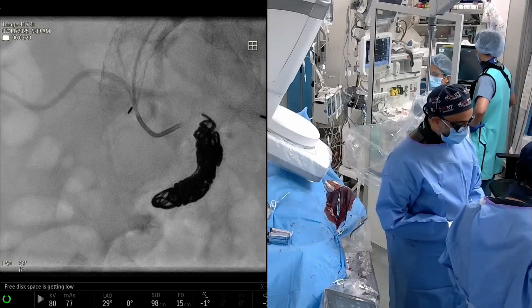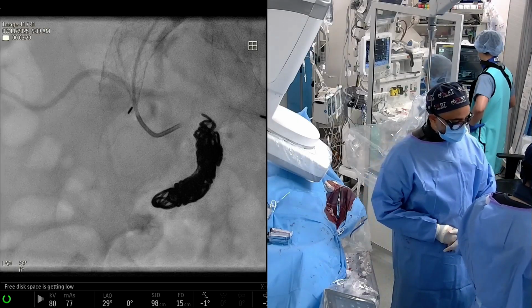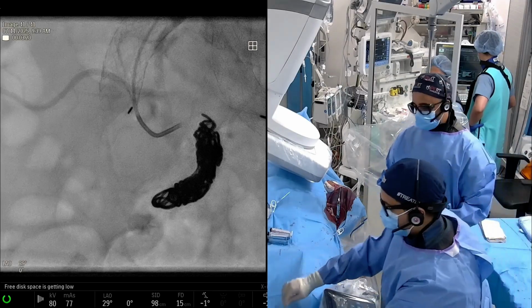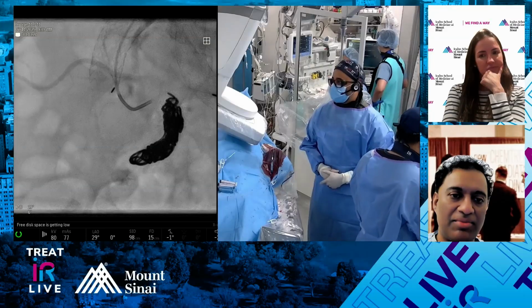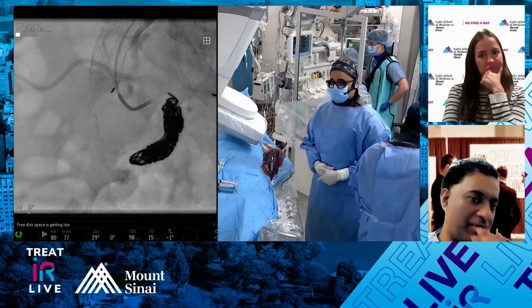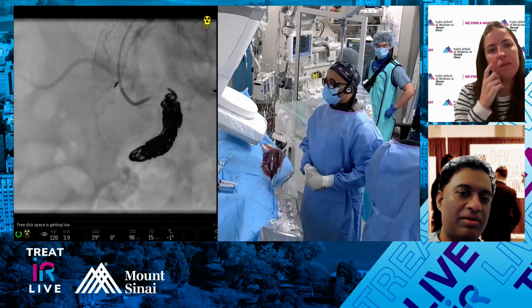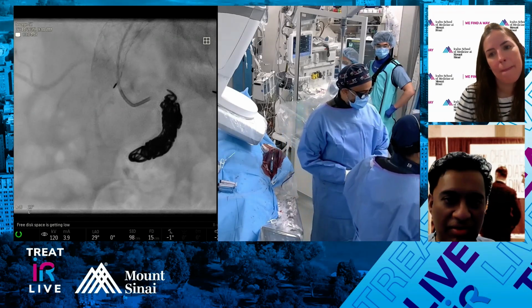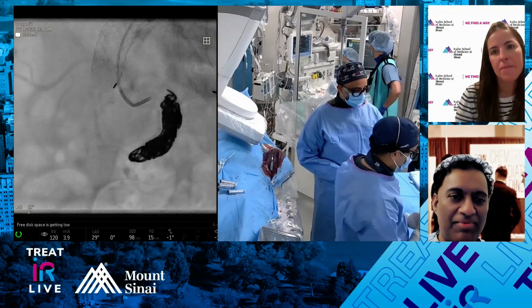Maybe on aneurysms we'll sometimes do that just because you get bored shoving coils until the cows come home. Switch to thick glue. Yeah, we haven't really done Obsidio. Honestly, even with this, you're probably going to be fine, right? You've shut down the anterior posterior division. There is a little bit of flow into that. They may retrofill, but I don't think it's likely. But if you throw a little bit into that horizontal portion, even a short 20 or 30, and just fill it, probably fine.